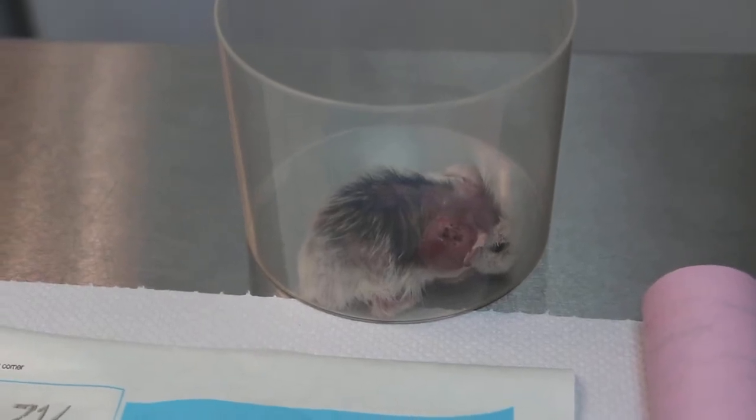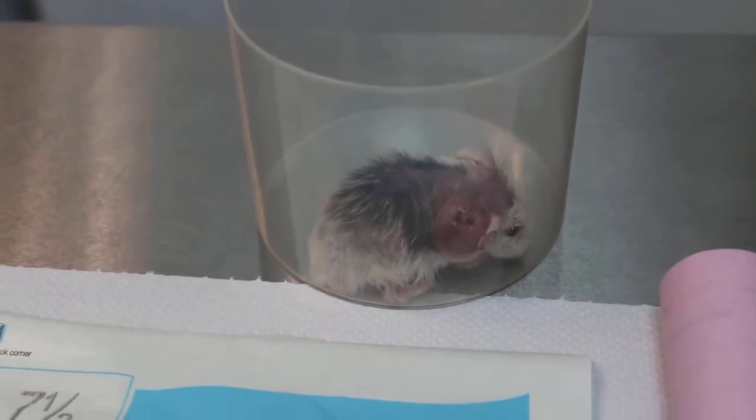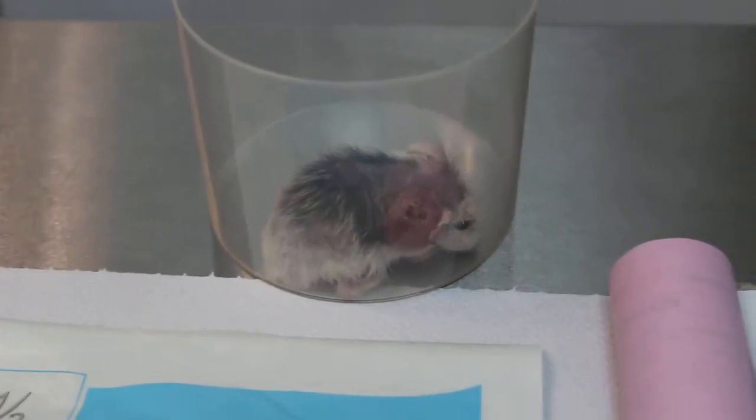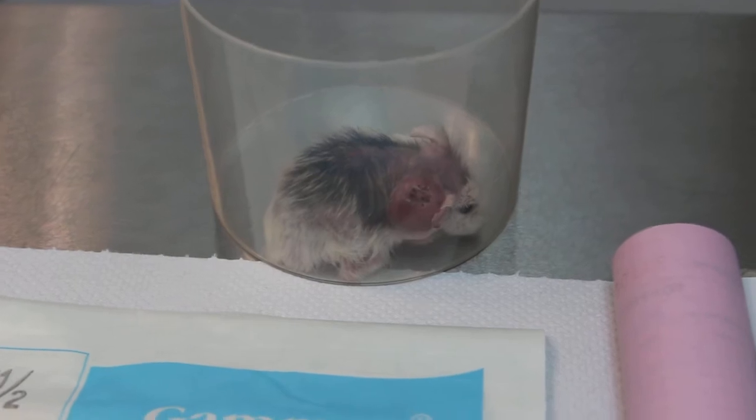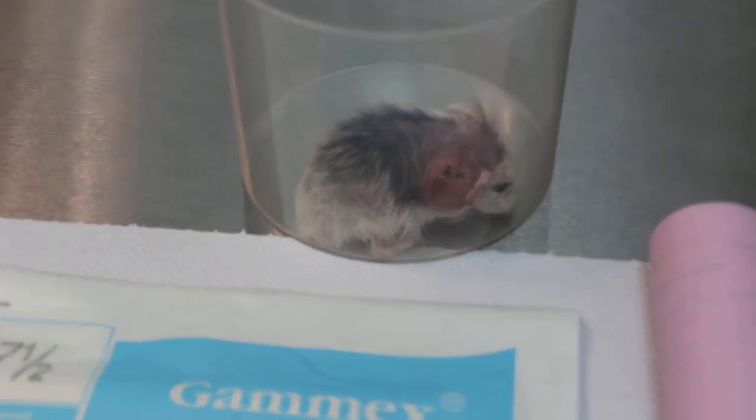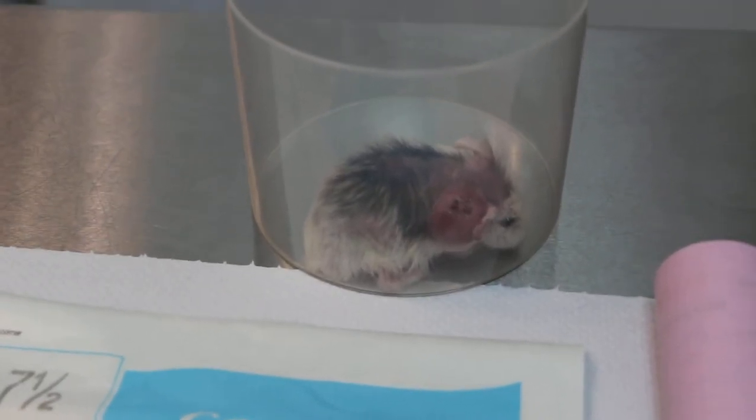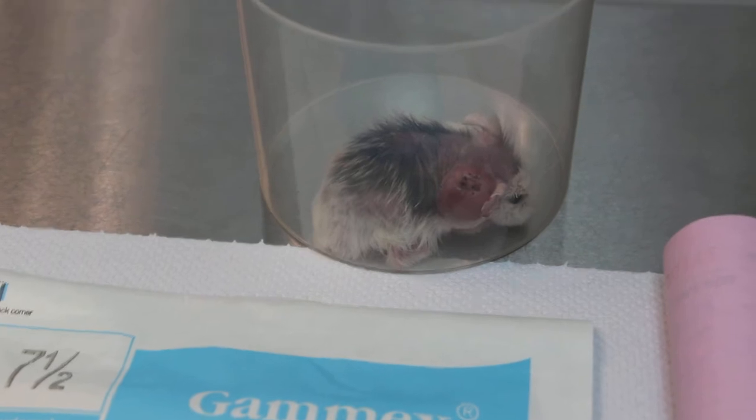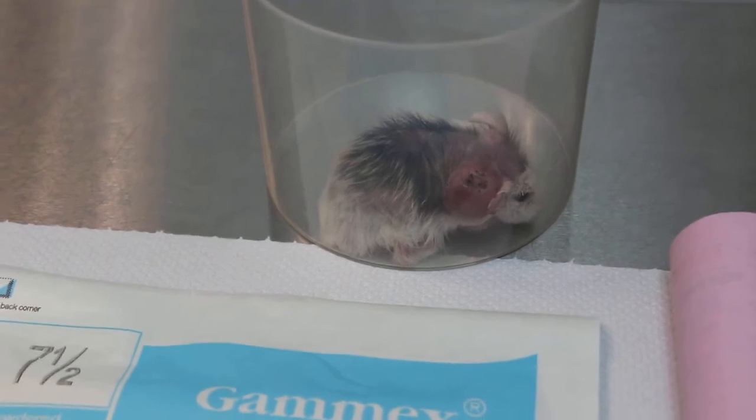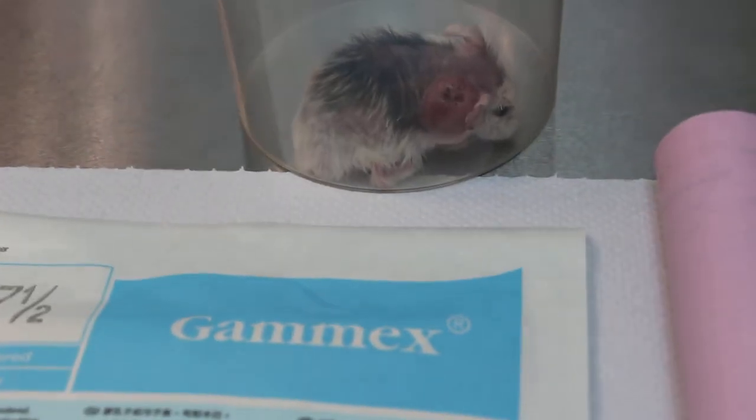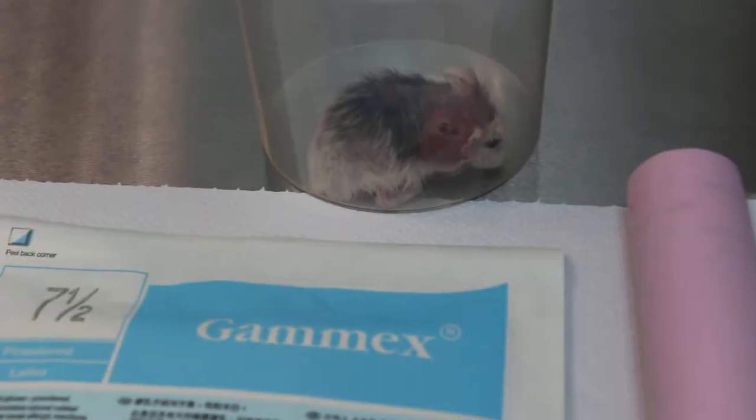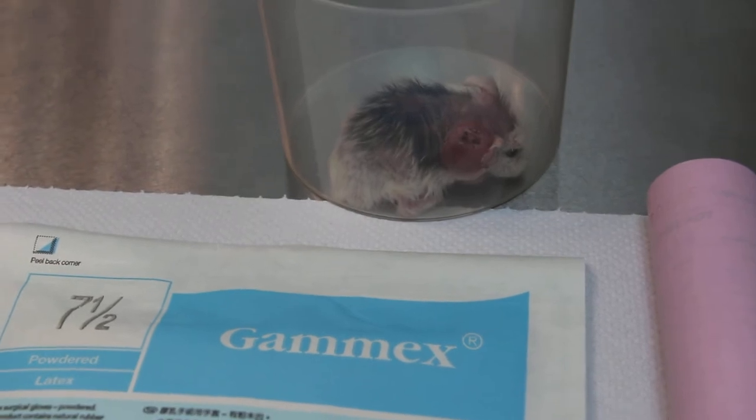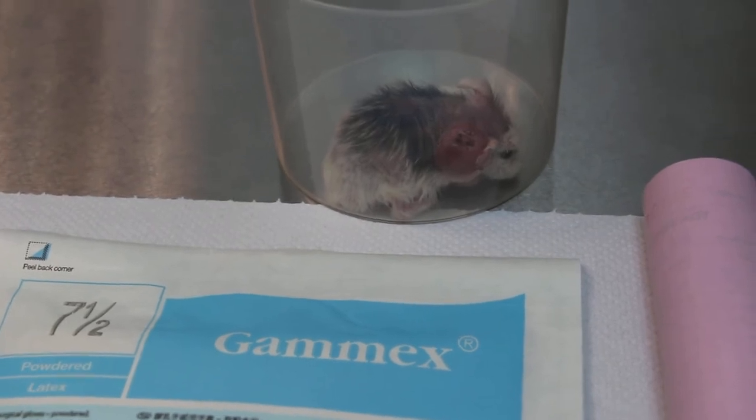November 8, 2013, 3:45 PM. Hamster, Roborovski, 2 years old male, with a right infected tumor behind the right ear.